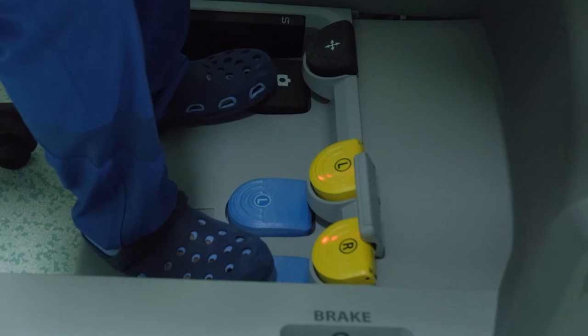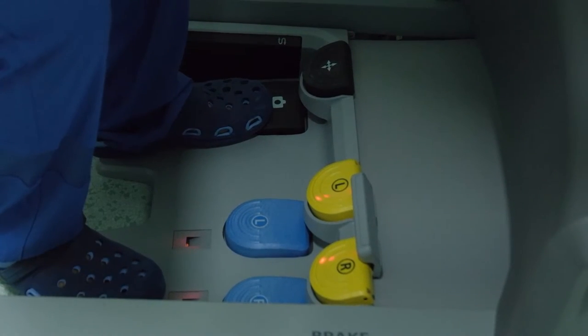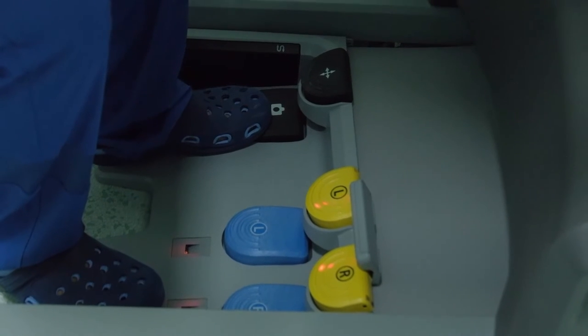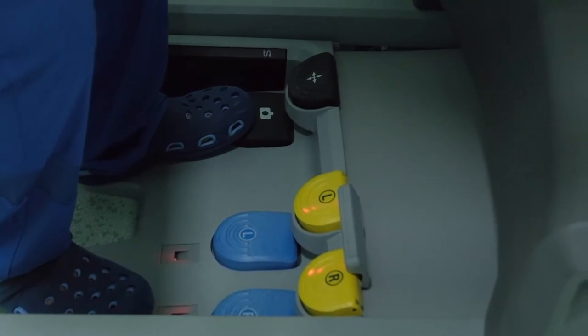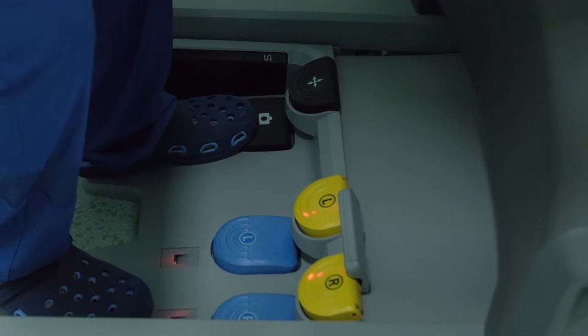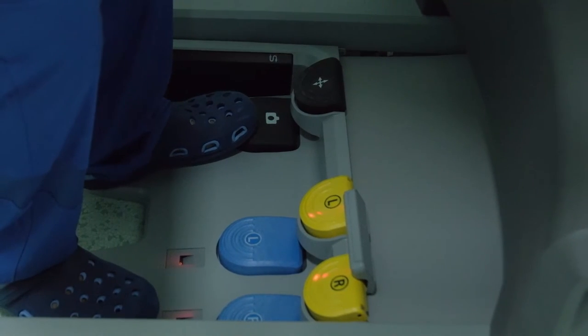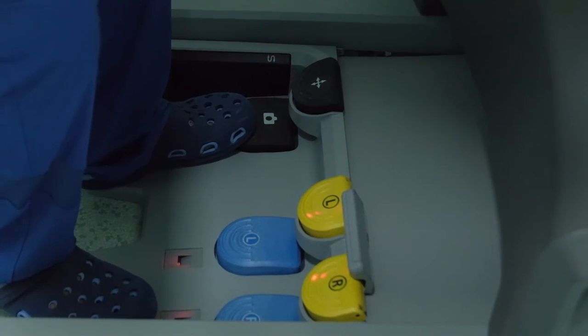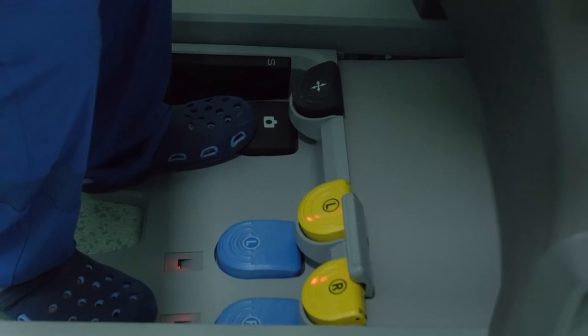I am right now pressing the camera pedal with my left foot, and what this is allowing me to do is to move in and out using the camera. I can zoom in very close and I can do a very precise job using this camera pedal, and I can again zoom in and zoom out. I can move it right or left, and we can also do a 30 degree up and right.